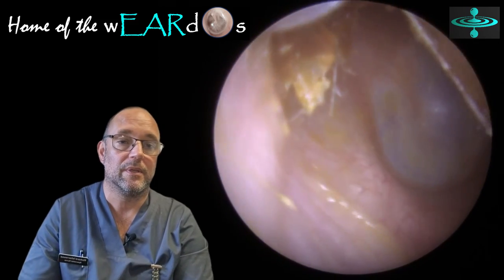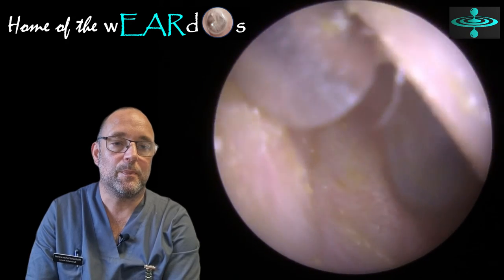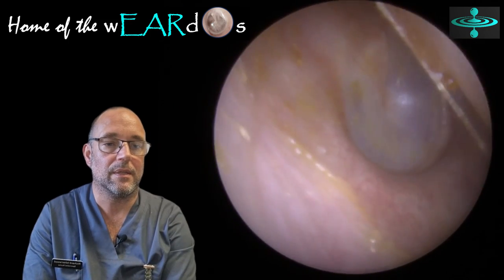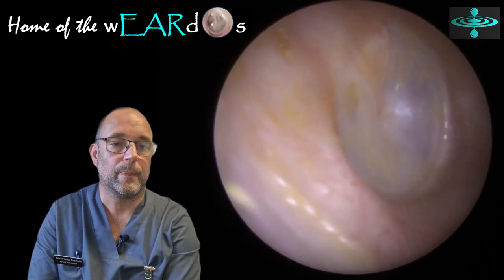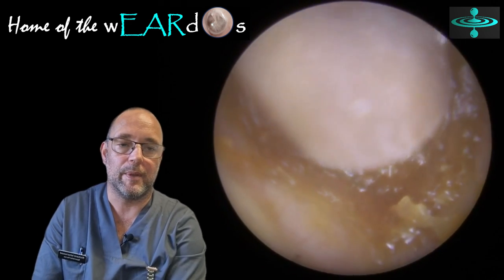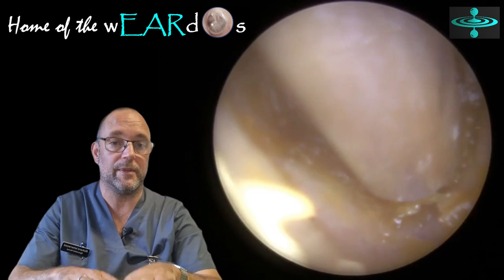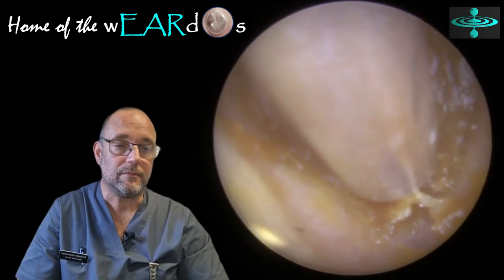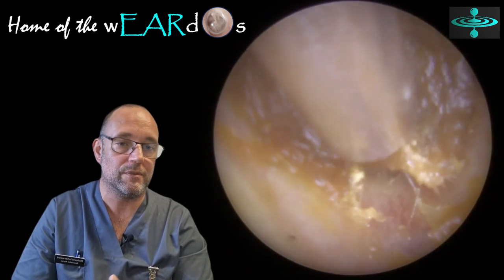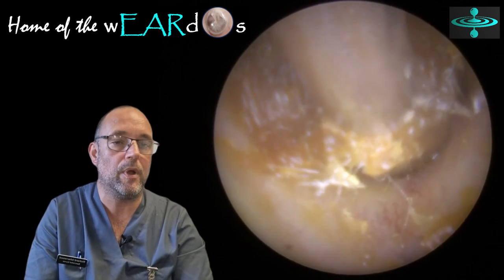It's like a shard, and it's left a little bit at the top there which was a bit tricky to get, but I still managed to get it. Have a look there — not a bad eardrum at all, really good. This one was a right pain because you can just see behind where the suction tube is — there's an indentation, it's kind of been smushed around the bottom and pushed right back, if not on the eardrum then just in front of it. The key to ones like this is to try and grab it from the bottom, which is what I've done there.